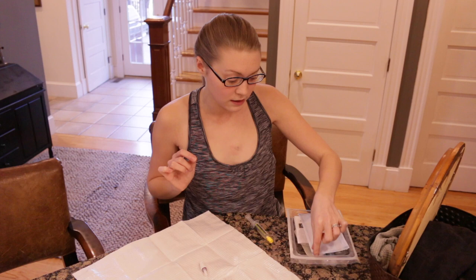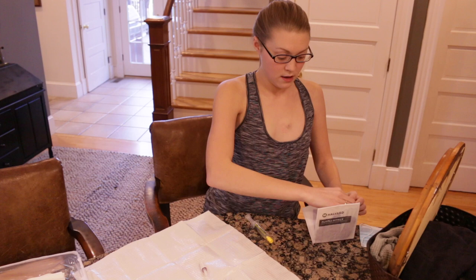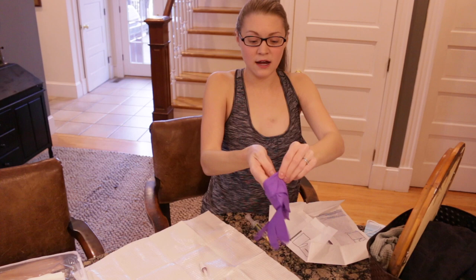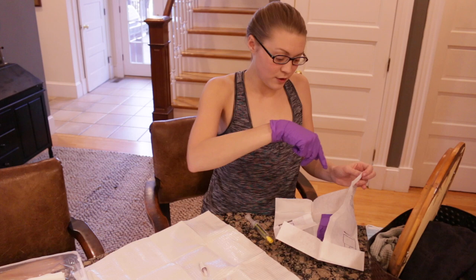Sterile gloves. You're going to want a little extra room, so I'm just going to move this to the side, pull my sterile gloves out of the container. They come in sterile paper, so you just open it up. You've got to remember not to touch anything — when you pick up the gloves you touch the cuff part. Take your time; this can be tedious, but take your time to get them on correctly. I'm only touching the inside of the cuff — nothing that's going to touch my port or the sterile field or anything else. Now this glove is still sterile so I can pick up the other glove and work it on.